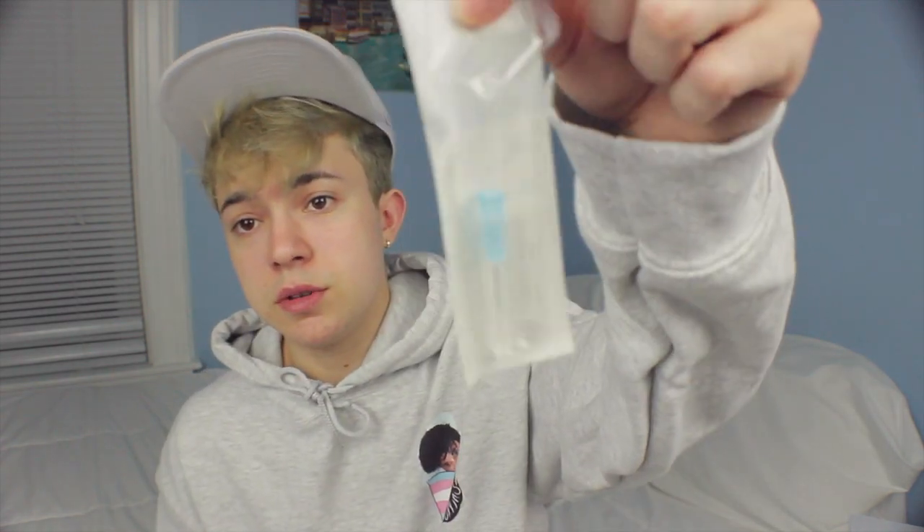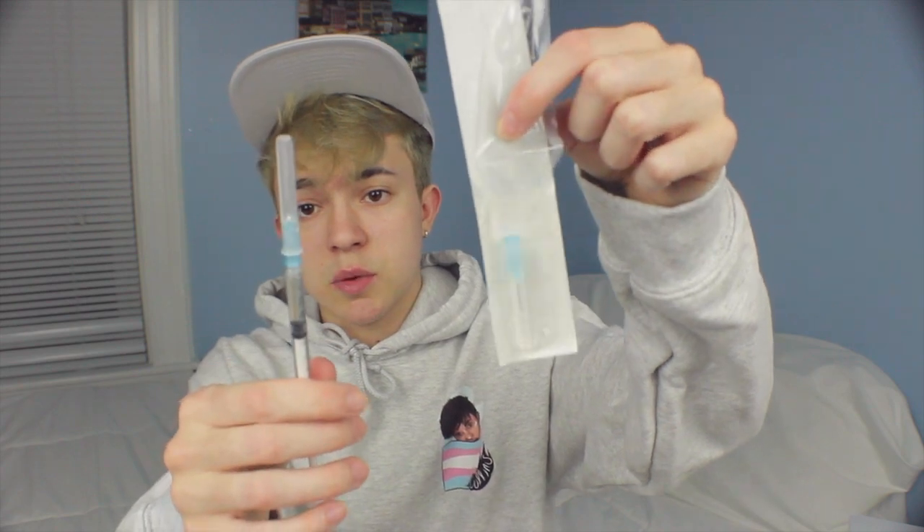Once you have your amount, what I do is I switch the tip — I don't use the same one I just used to draw up. I have the new tip right here and I'm going to switch it. You're going to put the old one in the sharps container.